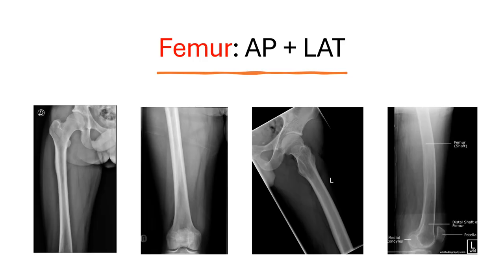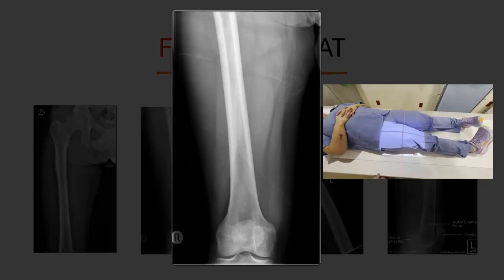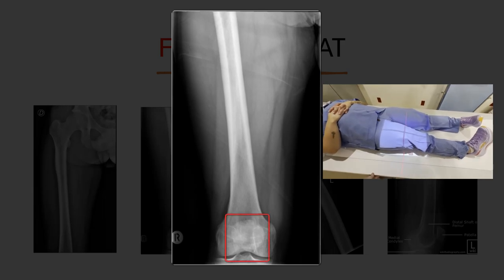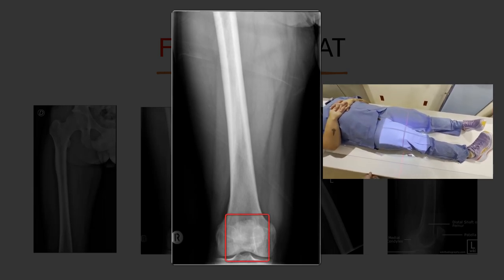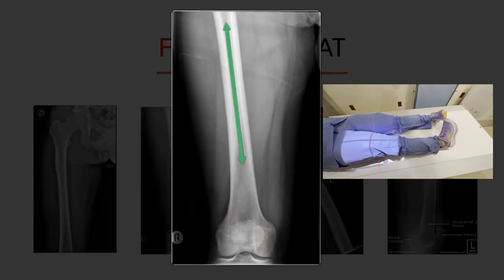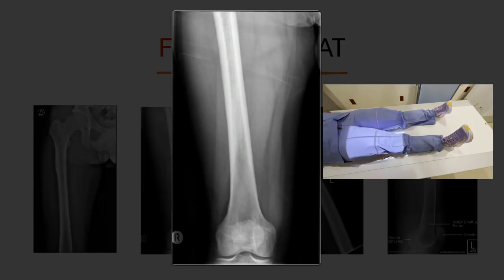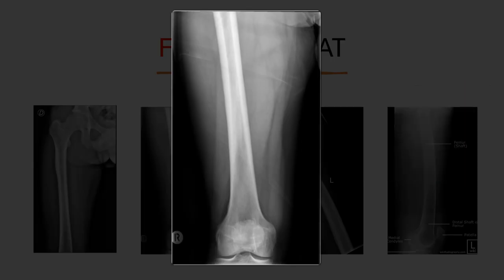And when you do, for the distal end, you're going to take off that 15 degrees of rotation, get the kneecap, the patella, straight up in the air. And it's okay to get a lot of overlap here because there's no reference point on the femur to tell the radiologist that you have overlap, unless they have like a piece of metal or something embedded in them. There's nothing there that's going to tell them that you got overlap. So it's okay to get a little bit extra here, just like they did in these pictures. I'm okay with that. And you can see the good marker placement there.